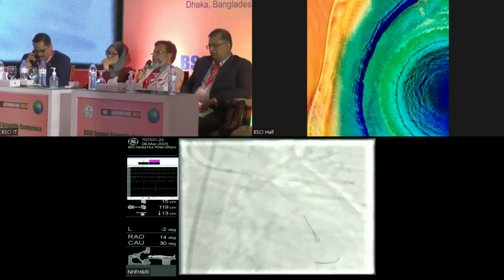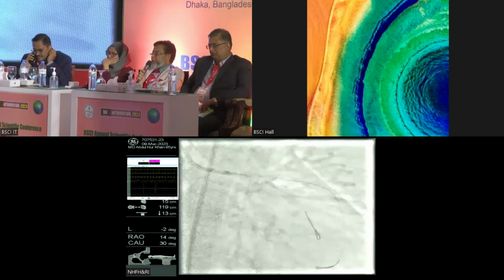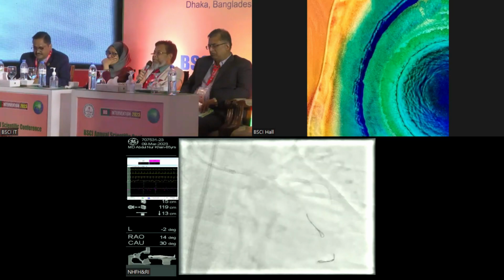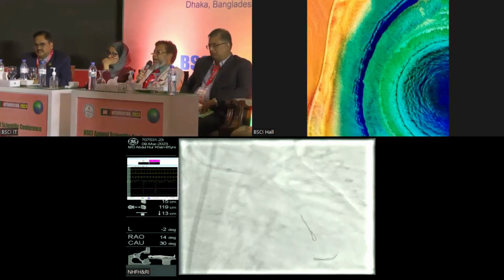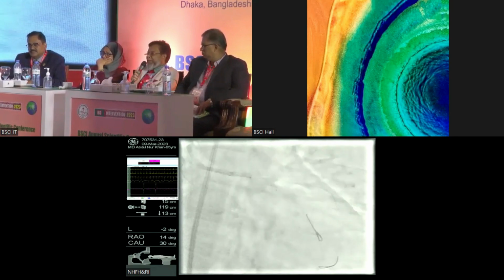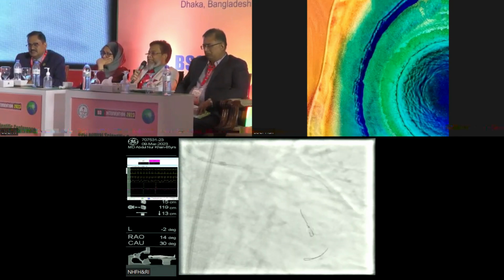Many a time we get LM patients. Very recently, we saw a young patient, 32 years old, who had angioplasty in a different center and came within 3 months with severe stenosis, and on the table the patient collapsed. Though we did a second LM angioplasty, it should not be done a second time. But due to the shock on the table, we went ahead. In that case, we saw the previous stent was distorted, most likely by the guide catheter.